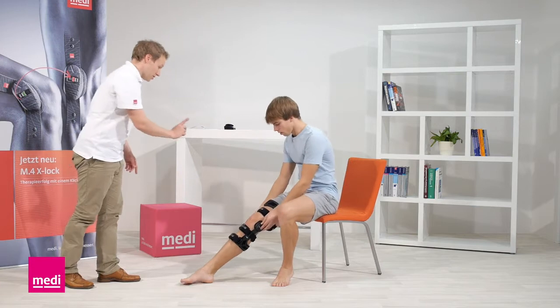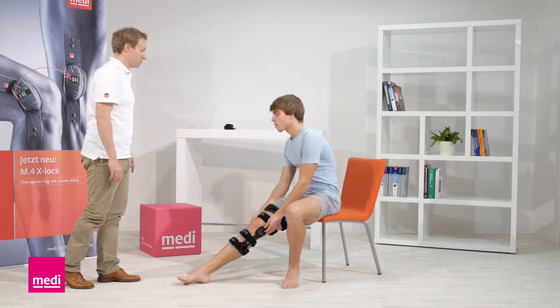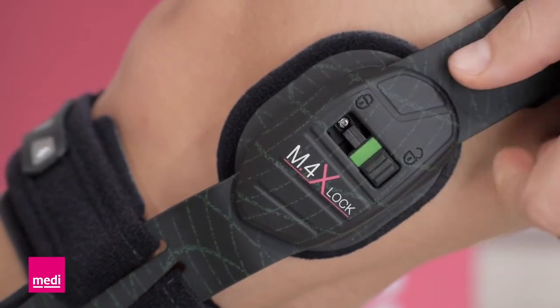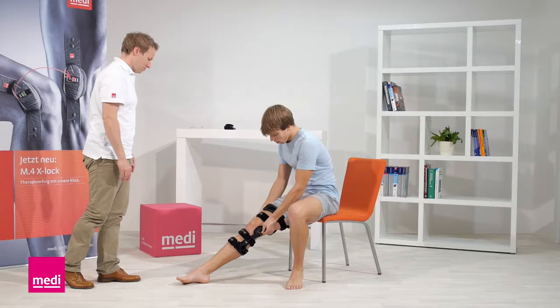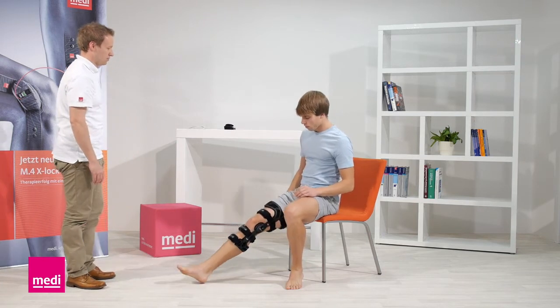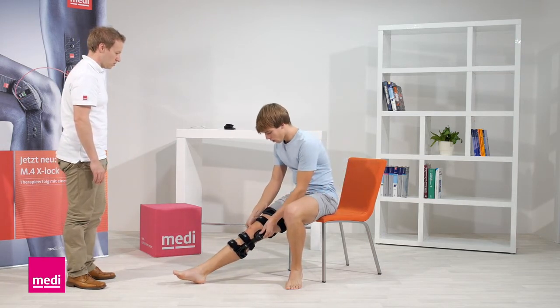When the leg is not weight-bearing, that is, when the patient is sitting or lying down, the mechanism can be set to green and thus unlocked. However, always remember to straighten your leg and set the locking mechanism to red before you stand up.